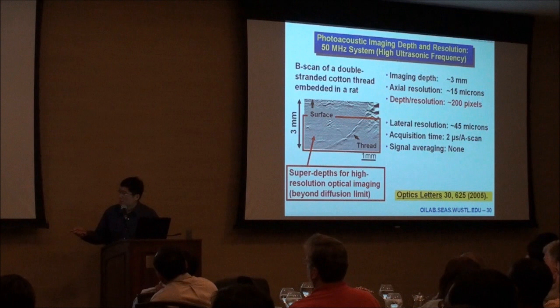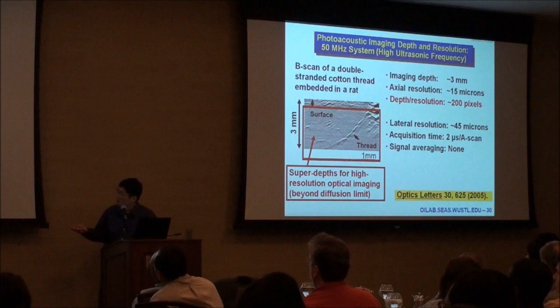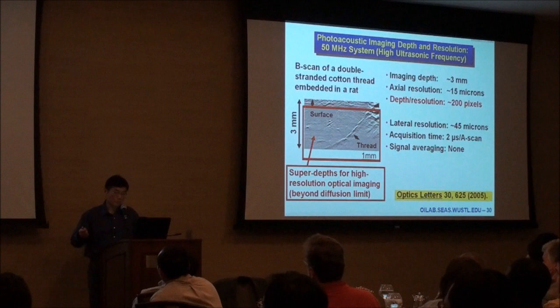And this is in the super depth range for microscopy already. And you can even scale this in both directions. So you can penetrate much deeper. In fact, in our lab, we scaled up to about 3 centimeters. And that's not even the limit.